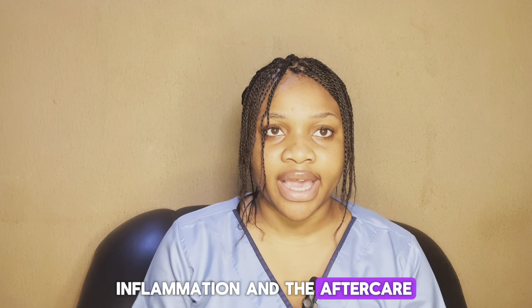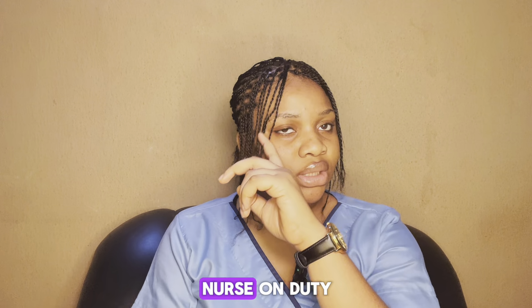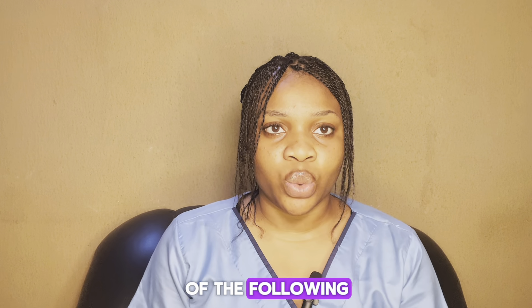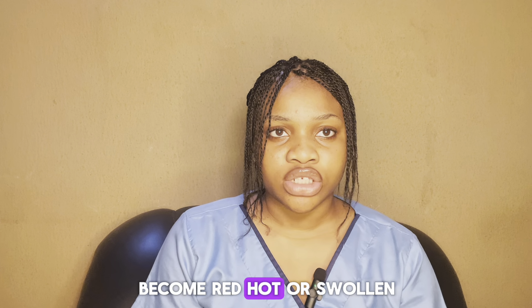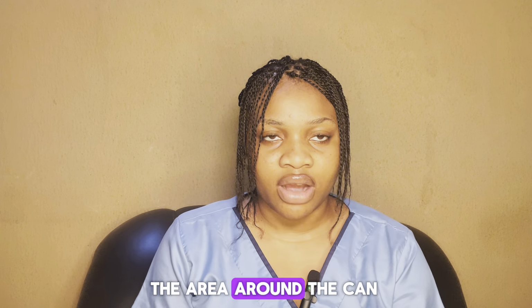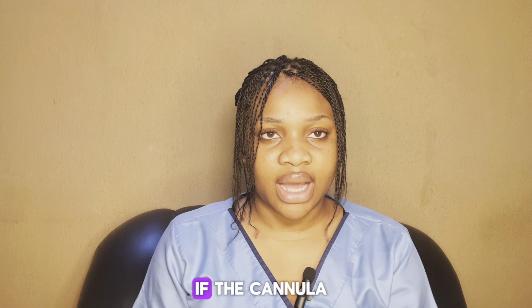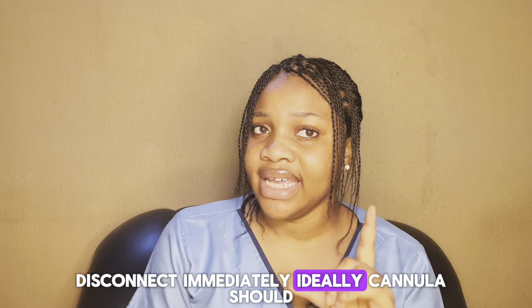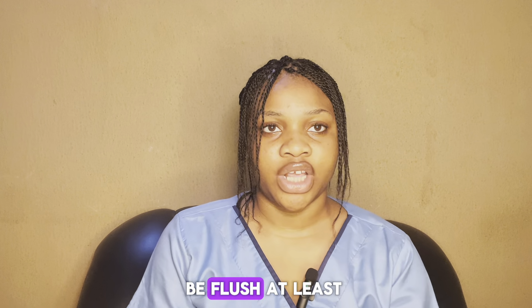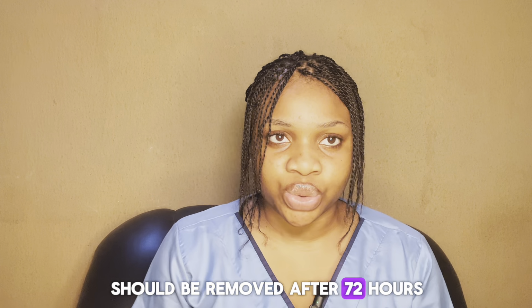Then the aftercare, you need to instruct the patient to inform the nurse on duty if they experience any of the following. One, if the site becomes red, hot or swollen. The area around the cannula feels wet. Or if the tape has become loose. If the cannula is limiting self-care, disconnect immediately. Ideally, the cannula should be flushed at least 3 times daily and should be removed after 72 hours.